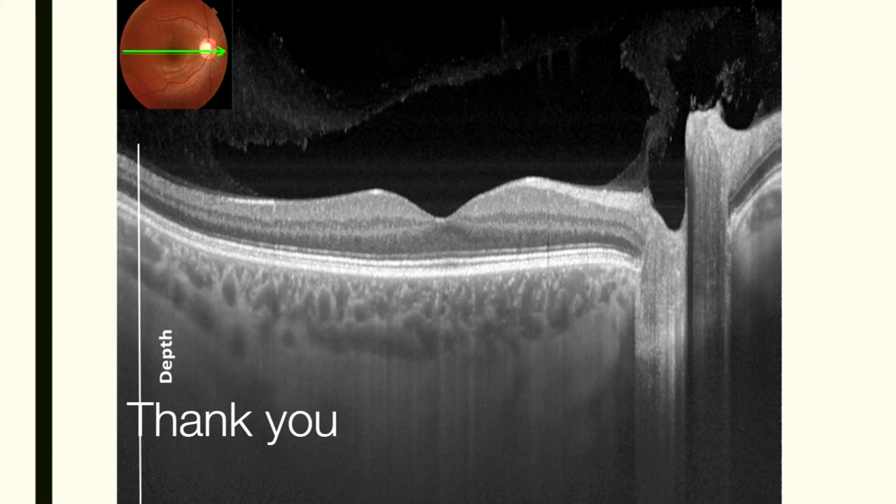You will have to use anterior segment OCT. So I'm not sure if even anterior segment gives you vessels of the conjunctiva. That you will have to use probably photography of the anterior segment and all. But Cirrus 6000 comes with an anterior segment OCT module as well, which is what we have. So most of the things in cornea, angle, you can see in front of the iris. The dictum is whatever is in front of the iris is very well seen on anterior segment OCT. Whatever is behind the iris is seen on UBM. That is usually the dictum.